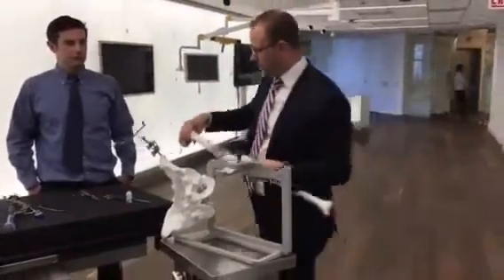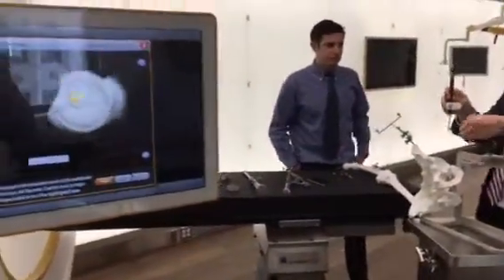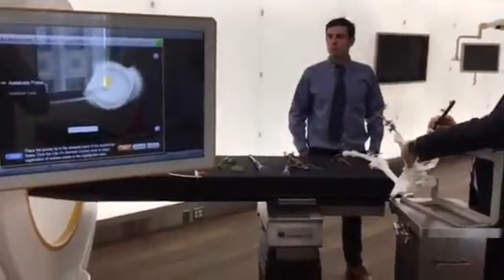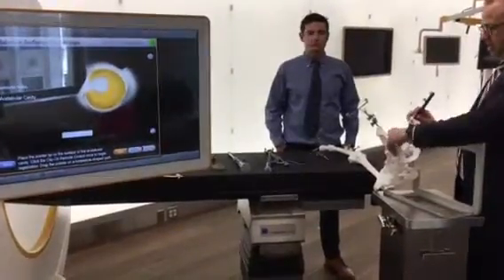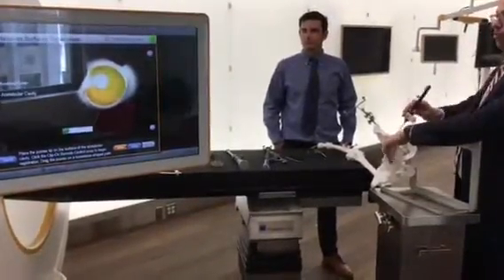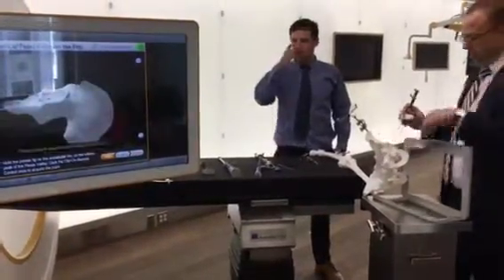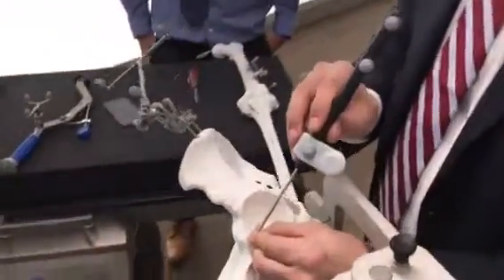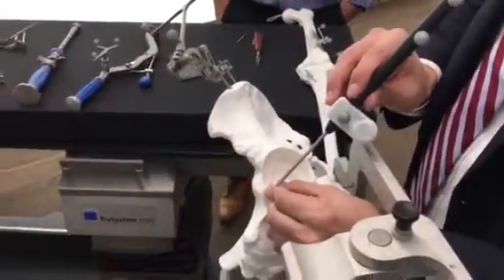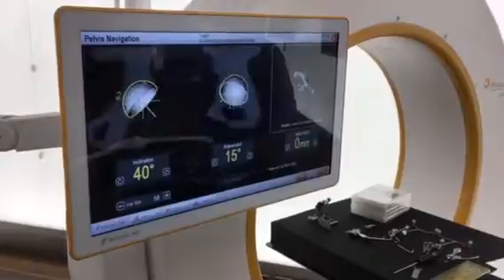I'm going to hand the entire leg off here, and I'll go in and continue this extremely simple registration with a fossa point here. So I'm going to click the pointer once here, rotate around the fossa. Then I'm going to start inside the acetabulum and paint through the acetabular articulating surface until I fill up the screen. Now I move to the anterior-most point on the screen, which we refer to as the inferior peak of the psoas valley. And a left hip, it's about 9 o'clock, and right hip, it's 3 o'clock. Single point there. And that's the entire registration for the case.